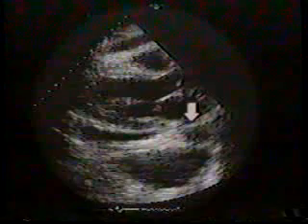This patient has both pleural and pericardial effusions. Here again, the parietal and visceral pericardia converge anterior to the aorta, so that only a small amount of pericardial fluid appears between the left atrium and the aorta. In contrast, the pleural effusion appears behind the descending aorta.